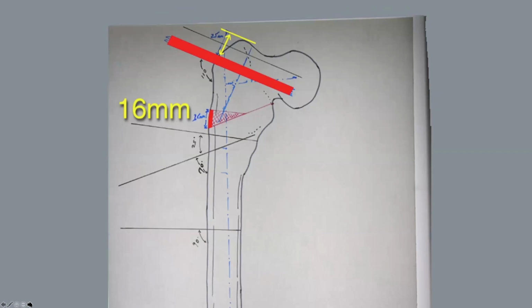The other thing I strongly recommend when you have a drawing is that you do these measurements, that you measure how far from the tip of the trochanter down you're going to put your blade plate seating chisel. And you can make a little mark on the actual femur intraoperatively, either a little bit of bovie mark or an osteotome mark, a small osteotome mark.